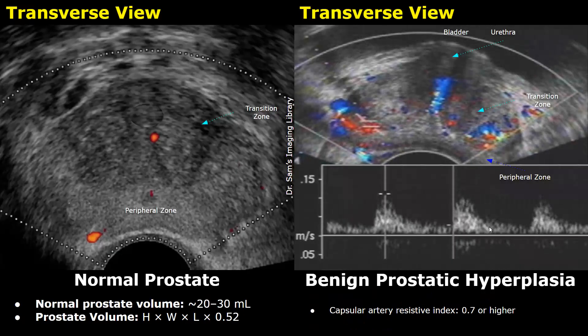One Doppler parameter that can be evaluated in BPH is the resistive index. In BPH, the resistive index of the capsular artery of the prostate is 0.7 or higher.